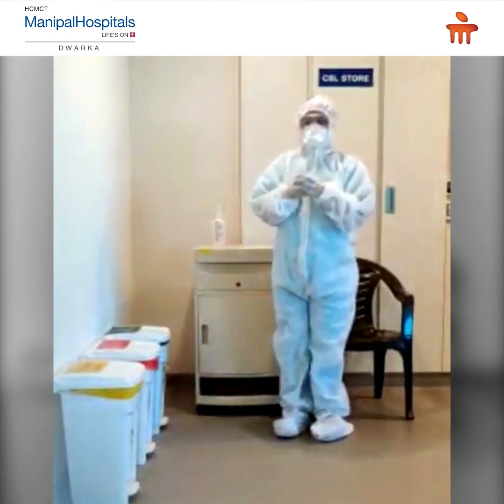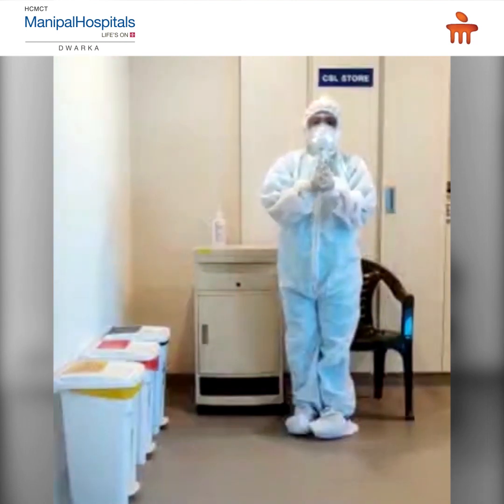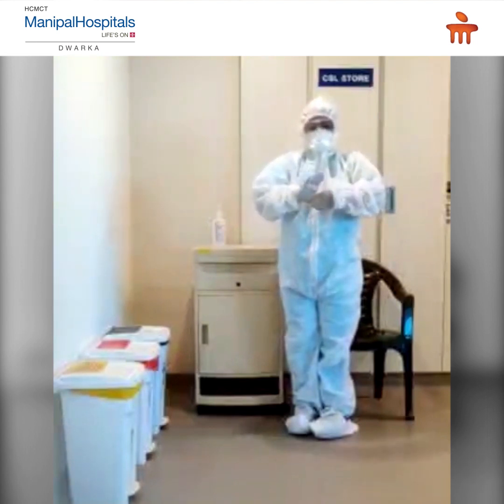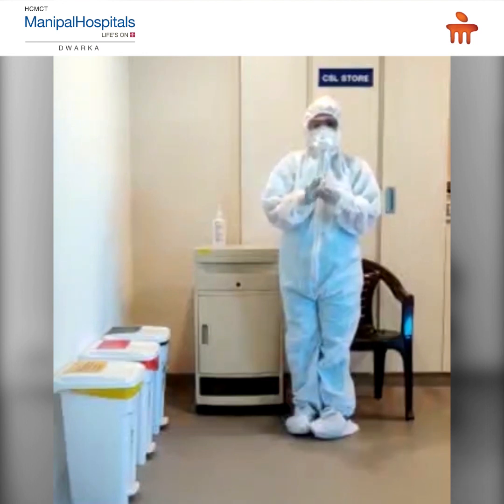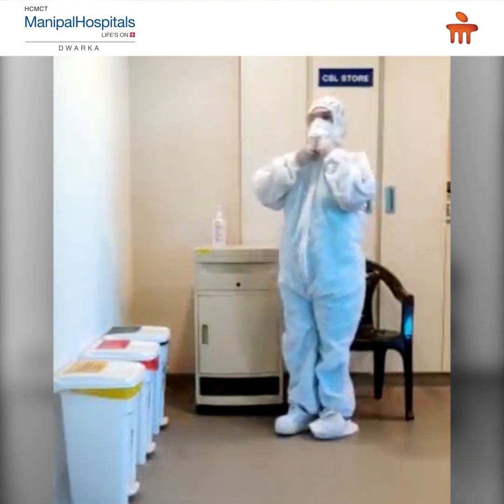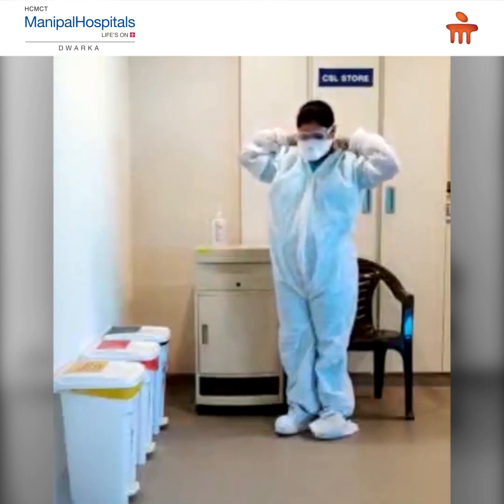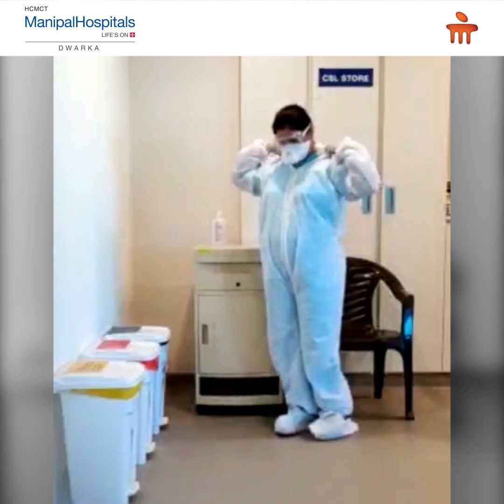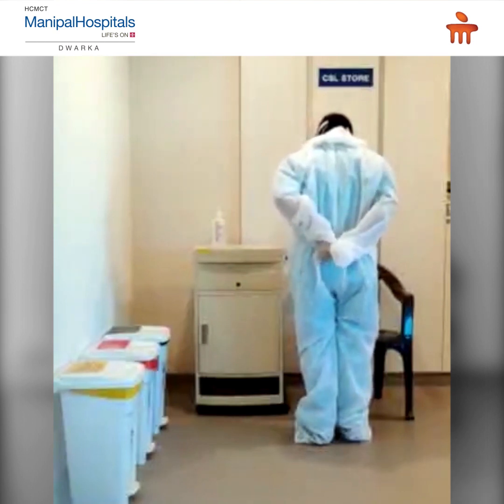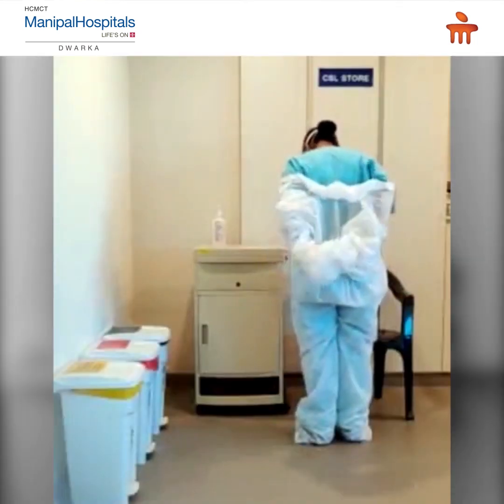Perform hand hygiene again. Remove the coverall gown. Slide back the hood by holding it from the top. Unzip the coverall gown and remove it by rolling it inside out.